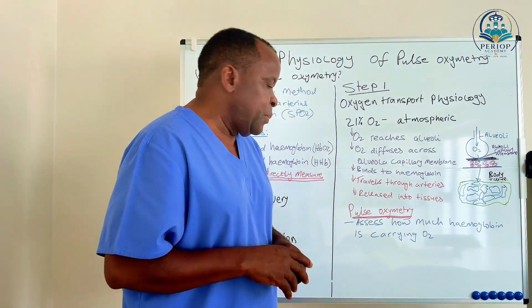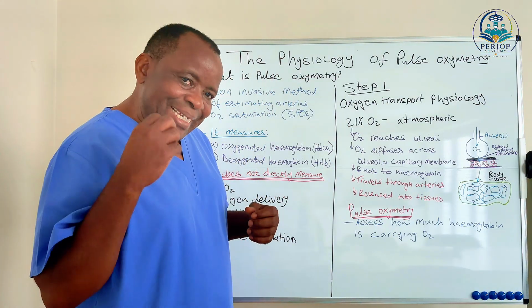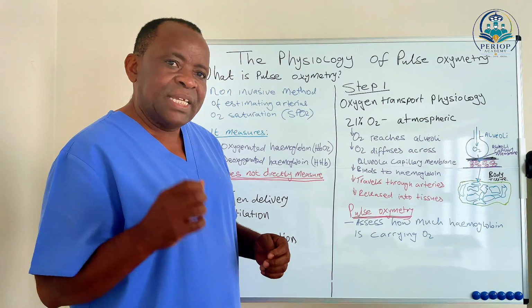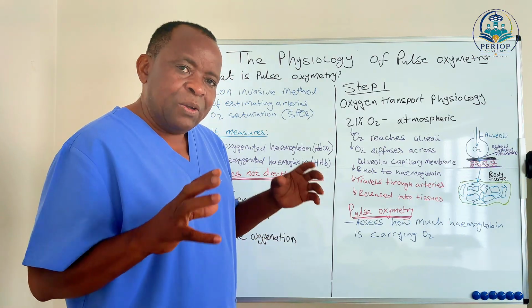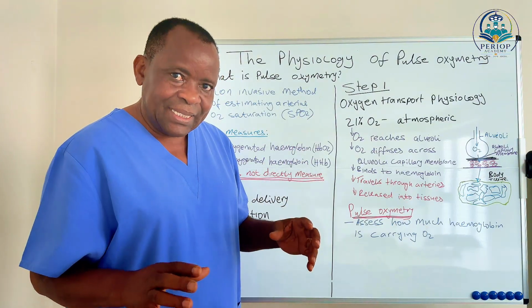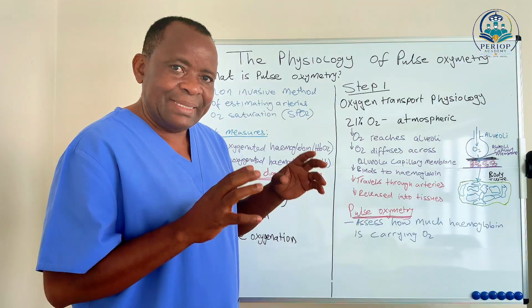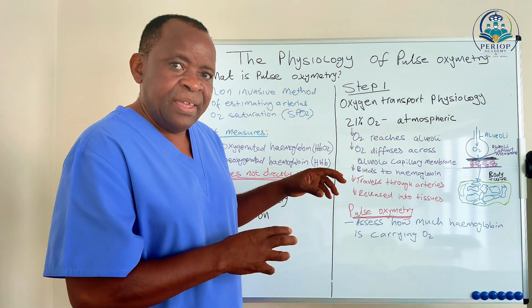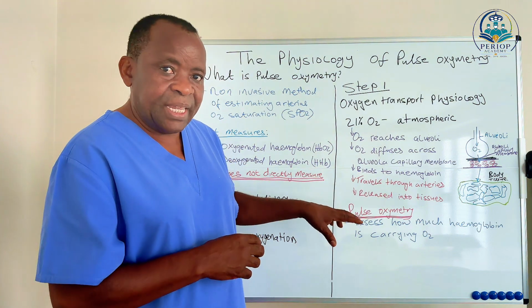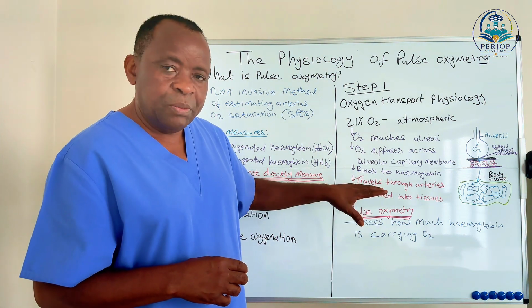Therefore, I want to inform you that the pulse oximeter per se assesses how much hemoglobin is carrying oxygen. That's the brief information I want to say about pulse oximetry at this stage as we move on.